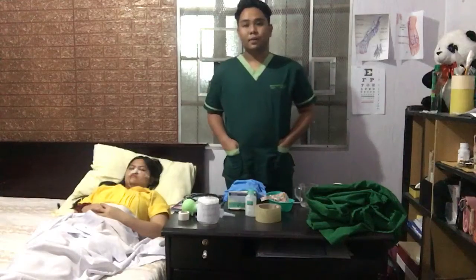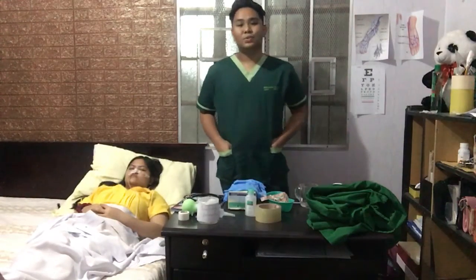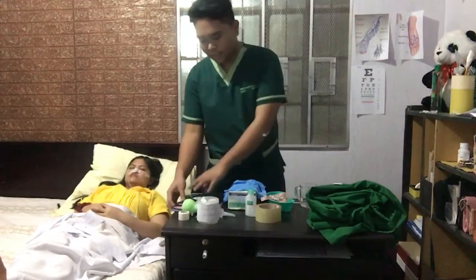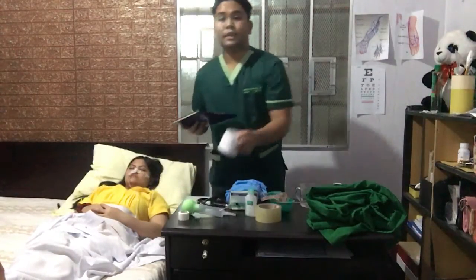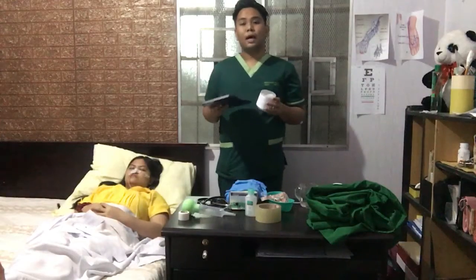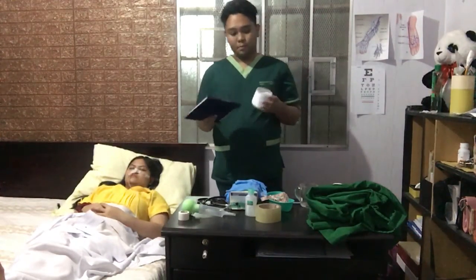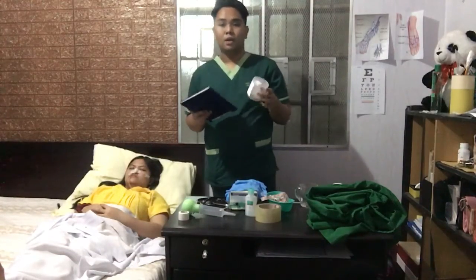So, number one na unang gagawin natin is yung assemble yung equipment po. Yung check po natin yung medical order po natin for the amount, concentration po, type and frequency of tube feeding on patient's chart. Then, check po natin yung expiration date po of the formula.